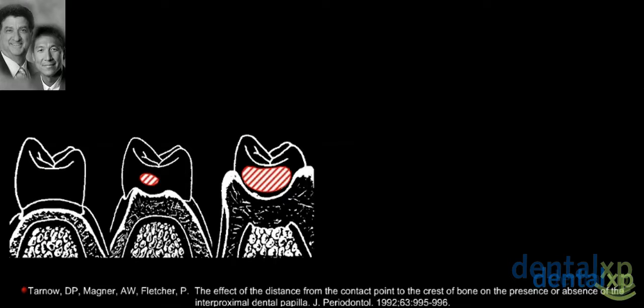And this is the classic. What happens is in the middle, you see there's a classic contact area about 1.5 millimeters, 2 millimeters in diameter. And there's a normal col that's present. Maybe you can point to that, Steve. There's a normal col that's present over here, buccal and lingual there. And there's a valley between the two. And the valley is non-keratinized. And that's what a normal papilla looks like.